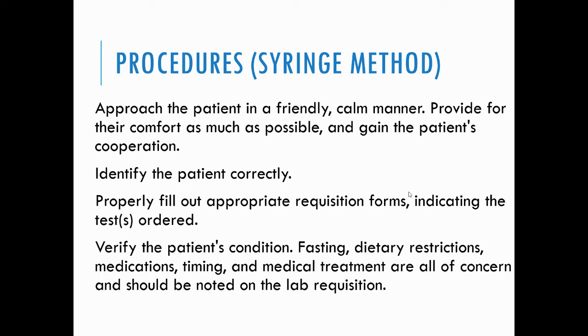We will need to fill out appropriate requisition forms indicating the tests ordered. So before pa niya nga magbuhat ka sa phlebotomy, so imong i-identify yung sa nga mga test imong kwaon, imong i-fill out properly ang ilang name, age, gender, ilang birth date, and verify the patient's condition if naka-fasting ba siya, if na ba siya mga dietary restrictions, medications, timing, and medical treatment kay para ang doktor nga magkuha sa iyang result kay makabulong na siya fasting mo na taas iyang ay nang ingani ang result na siya mga dietary restrictions mo na dili siya pwede nganion na siya mga medication mo na maka-alter siya sa uban nga mga test nga giran sa hematology, sa clinical chemistry.